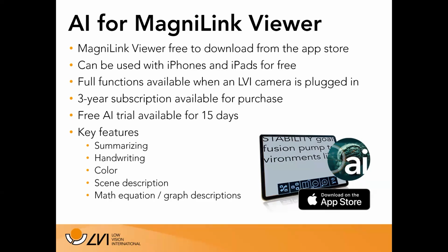When you use it for free, you're only going to get a few of the key functions. In other words, increase magnification, decrease magnification. You can change your color to false colors to improve contrast, and you can use screen masking, some things like that. So as just a simple magnifying app, it's a really good app.